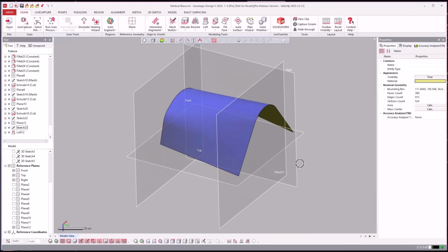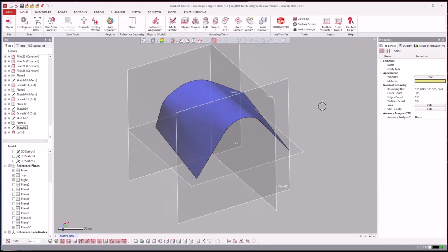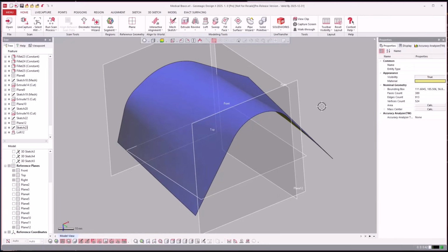So that's something that I wanted to point out, that when you're doing these lofts, you have the ability to draw it as a line arc sketch and dimension it out with the convenience of line arcs, then convert over to splines and keep the line arc geometry if you need to, and then once they're splines, give them the same amount of numbered nodes, then loft it together, and your lofts will thank you. So on a surface modeling project, a lot like this one right here, that is a very valuable aspect to be able to use that tool.